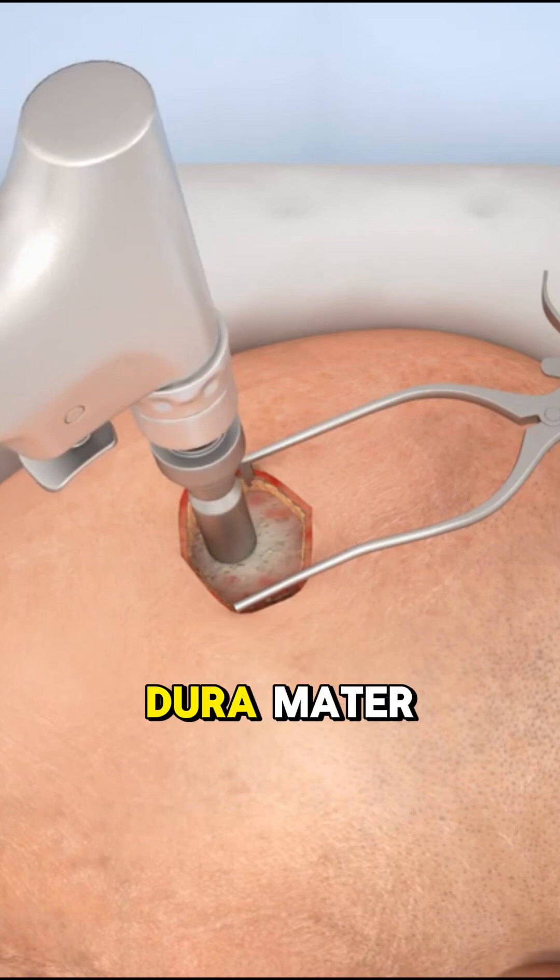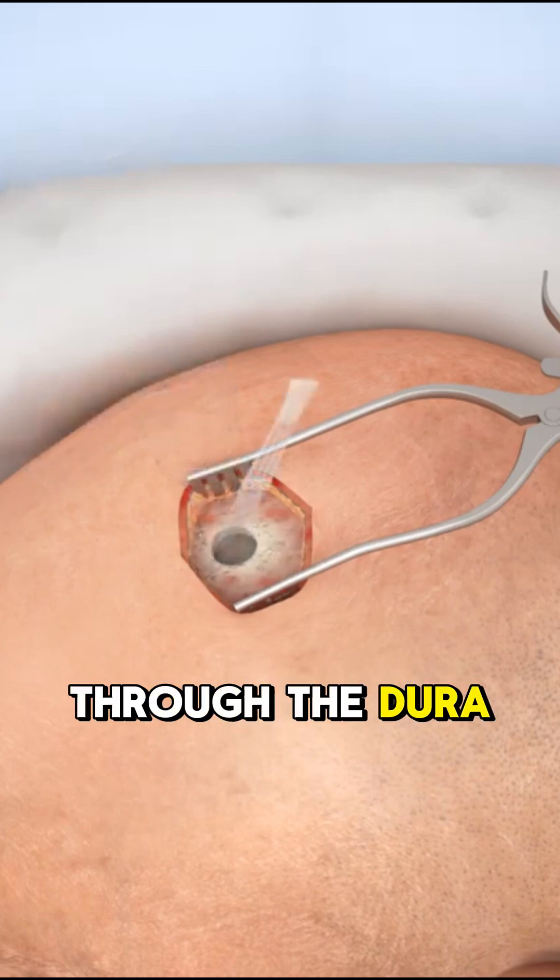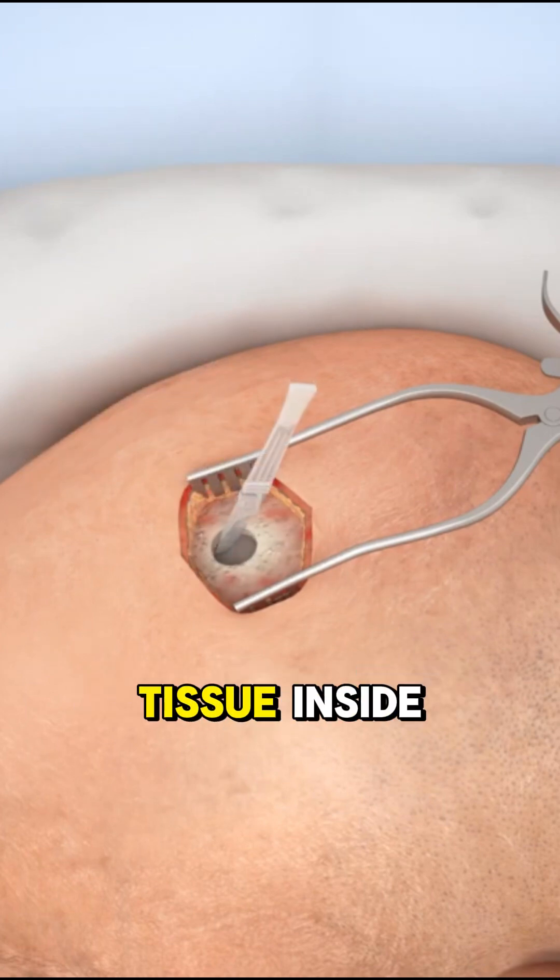Underneath lies the dura mater, a tough protective membrane around the brain. Another scalpel cuts through the dura, revealing the soft tissue inside.